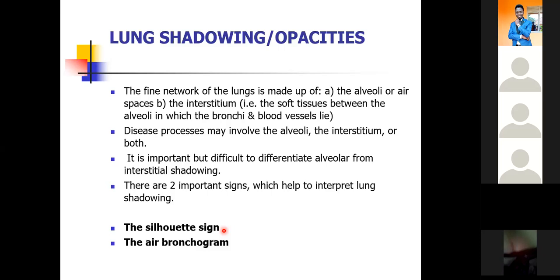Then there are also those disease processes that will transform the lungs from looking black to looking even blacker, if at all that word exists.